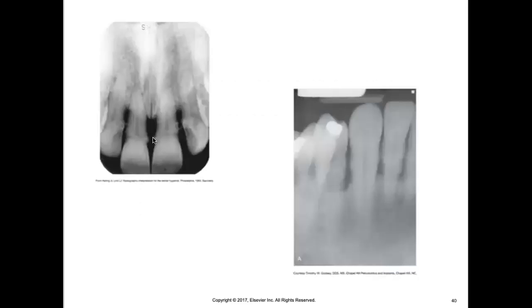And so these are these little nodules or little barnacles that we see on the cementum. They're just kind of growing. This is all very dense calculus. Usually calculus that can be seen at all in a radiograph is something that is actually pretty severe, and it would look worse in the mouth or under the gum tissue.